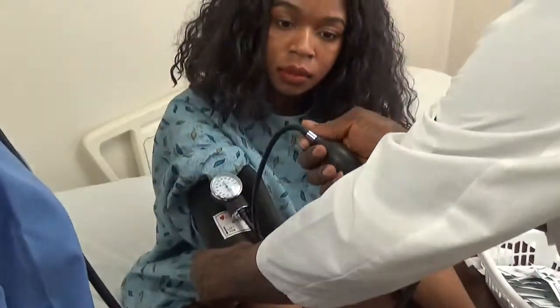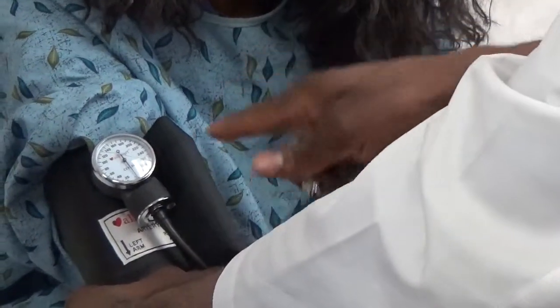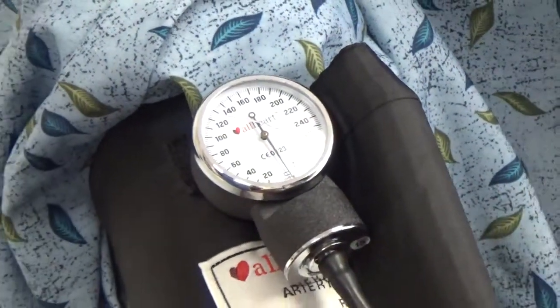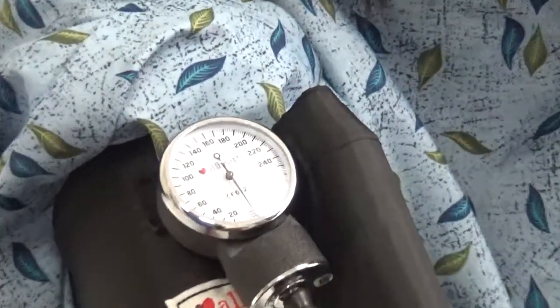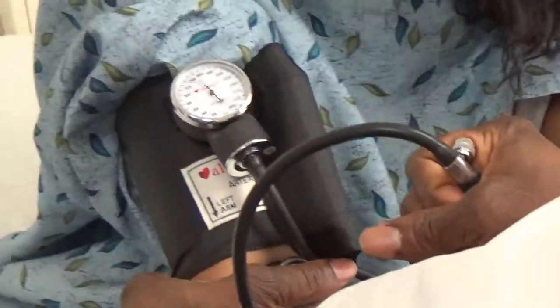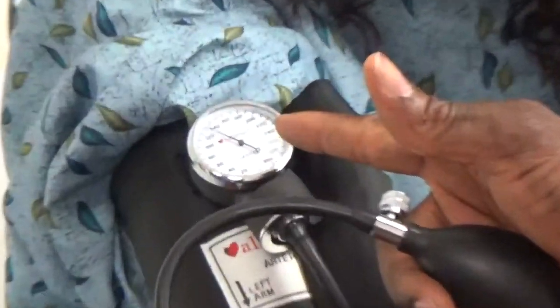Then close the knob, but not too tight because you are going to slowly open it. You are supposed to pump all the way to 180 before you start releasing it slowly. If you release it and immediately hear a sound, you are supposed to deflate completely and inflate to 200. So let's inflate now. Make sure you are holding the pump in a way that will allow you to handle it correctly. Pump all the way to 180, then slowly deflate, watching the meter and listening.